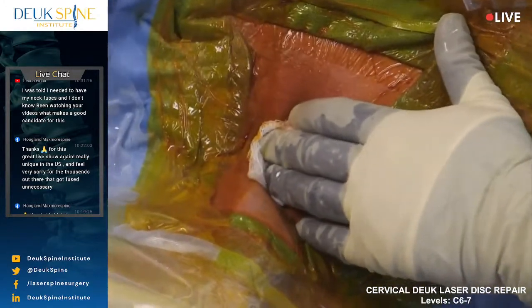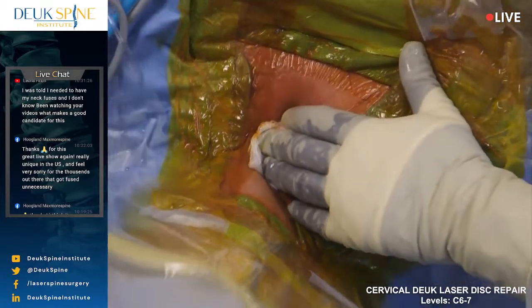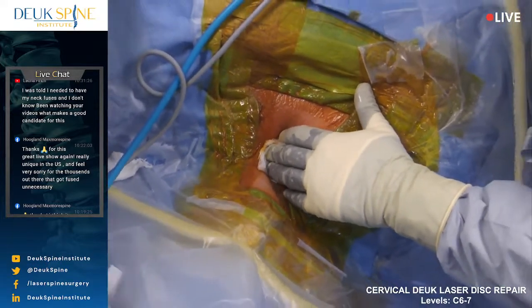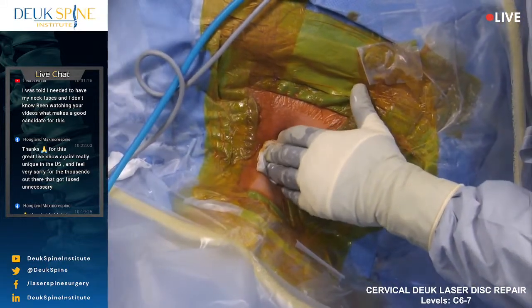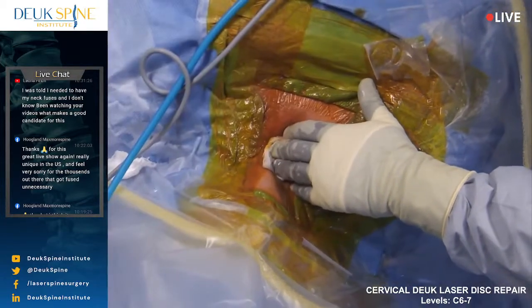And he's bucking a little bit, Doc. I don't know if you can just get him down for another couple of minutes while we put his bandage on. Yeah, he's going down.